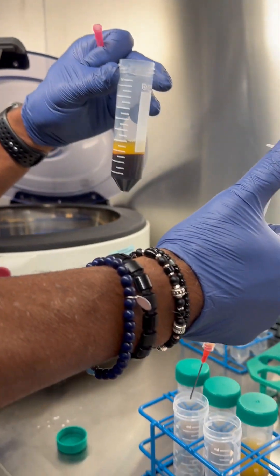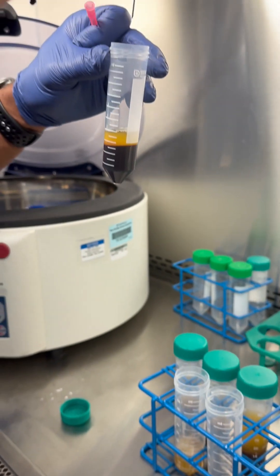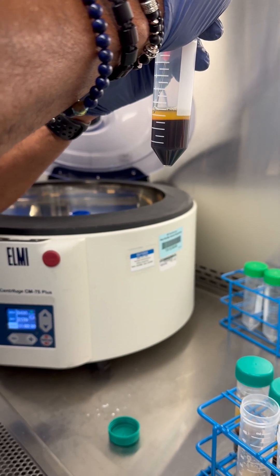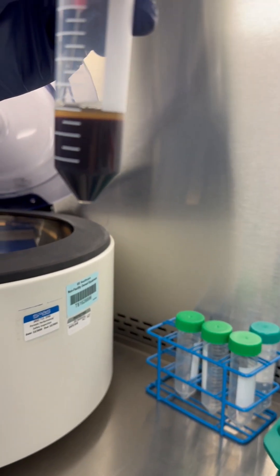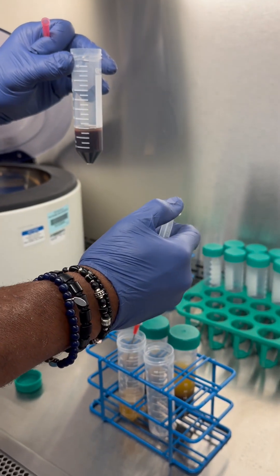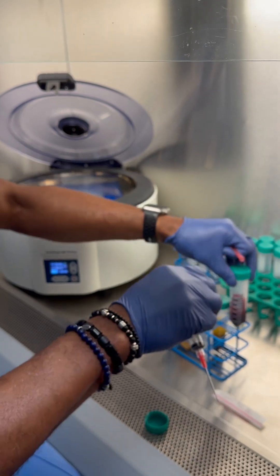We put the blunt needle in here. Can you see the interface? We just get down to about — you have to back up a little bit. So that's what we're going to leave. If this was just a 60cc draw, we would save this tube and use it to counterbalance along with the other one.